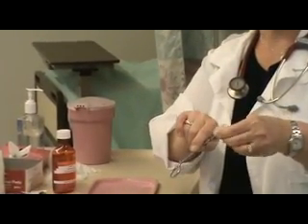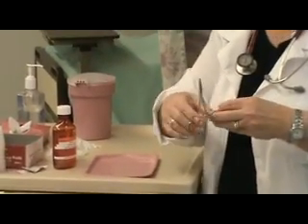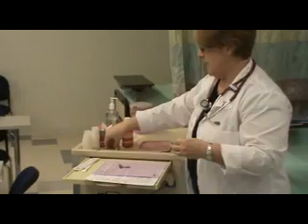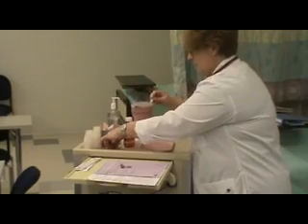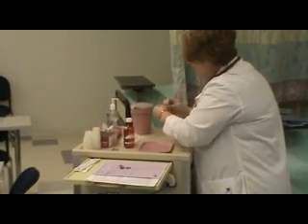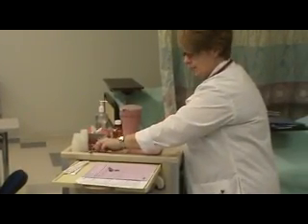So I clean these first, making sure they're clean, so that I'm ready to use them, something like tweezers, to pluck that residue out. I recommend that you bring your own for that, because the school doesn't provide those. I'm going to keep my own garbage off to the side here. Okay. And I'm ready to begin.